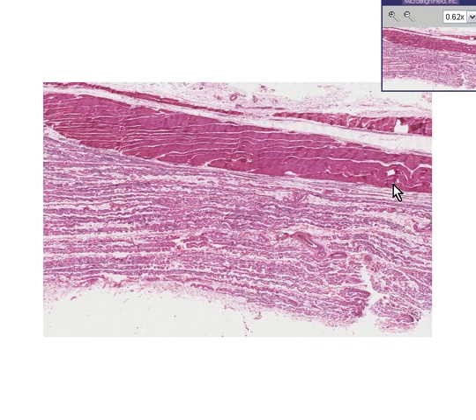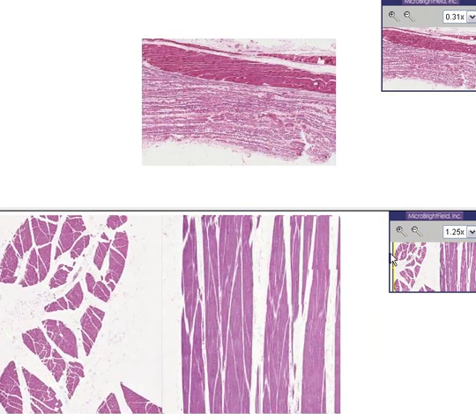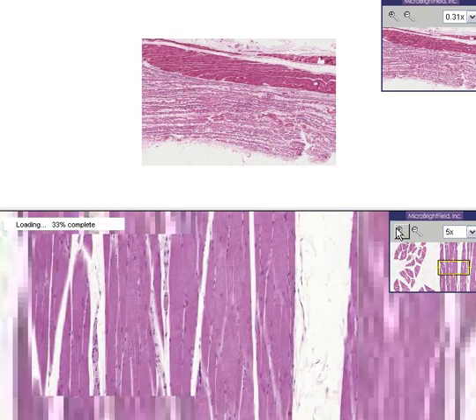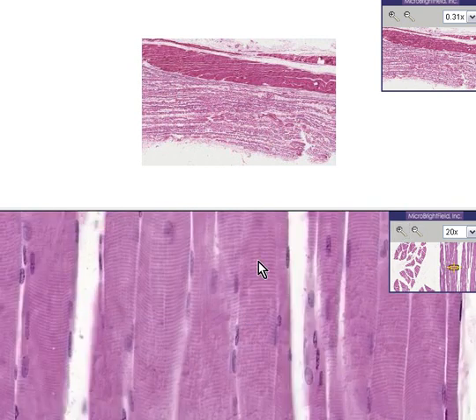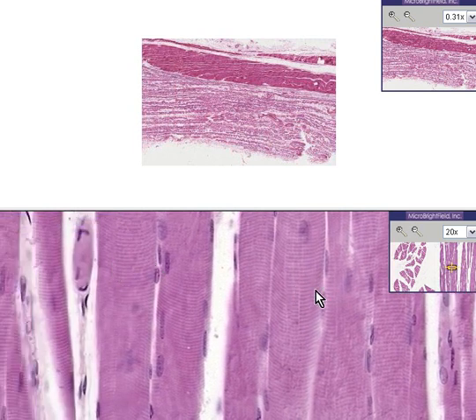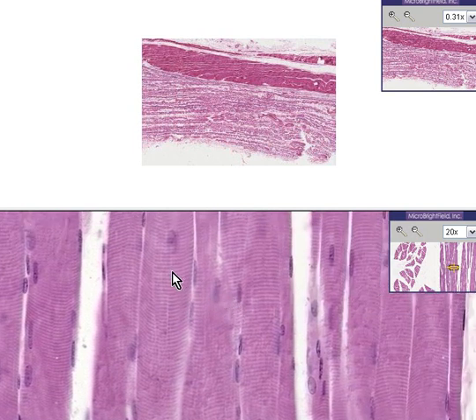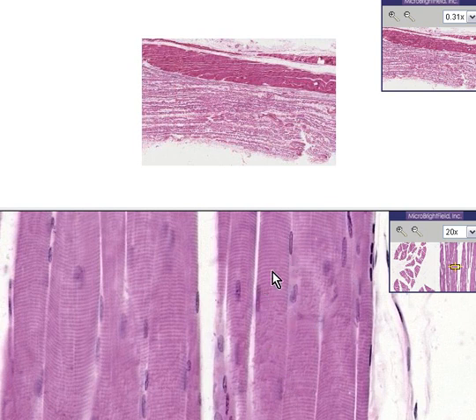Here is the disease in question to be discussed today regarding skeletal muscle. And here on the bottom is absolutely normal skeletal muscle. Let's look at it and look at all the salient features. I think you can very easily see the striations. I think you could see that the muscle fibers are basically right next to each other, lined up like logs. I think you could see that the nuclei are at the periphery of the fiber.